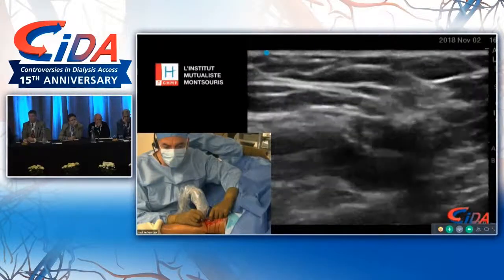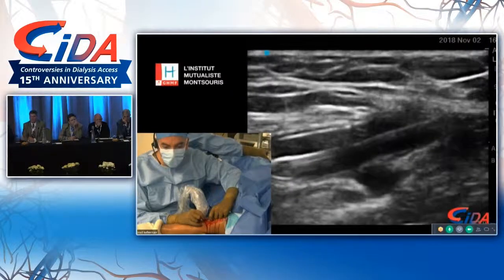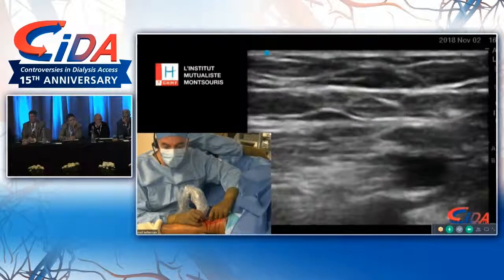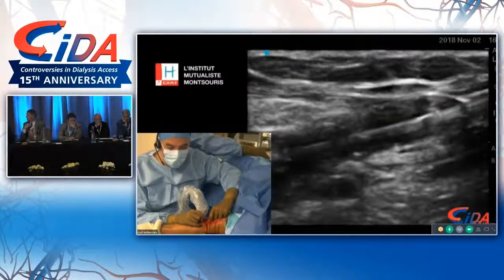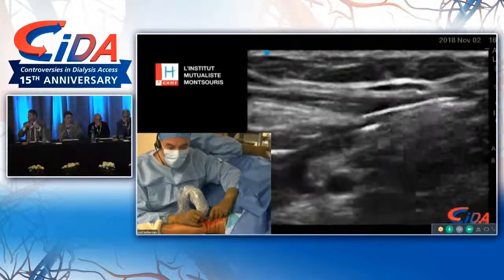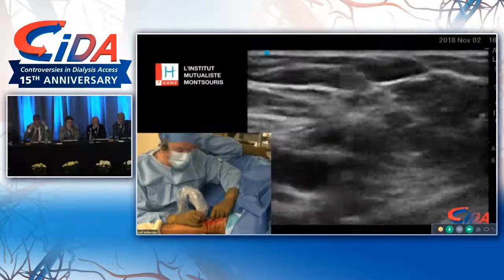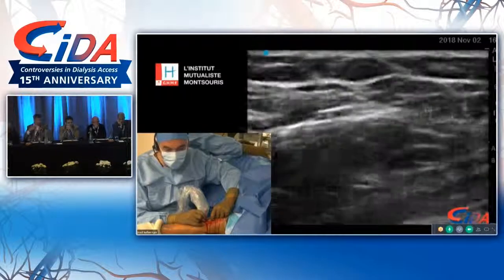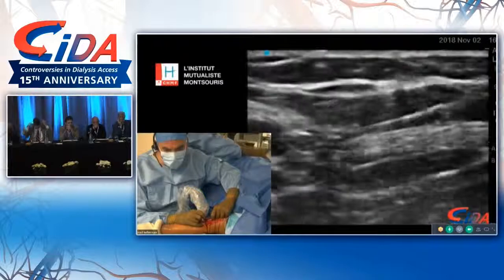You see the artery coming in here. You see the artery that is meeting the balloon. So I know that I'm inflating well the anastomosis and the perforator. So I'm going to pull the balloon back with the sheath all together, and I'm going to inflate the perforator a bit higher. And now I'm inflating the whole length of the perforator.